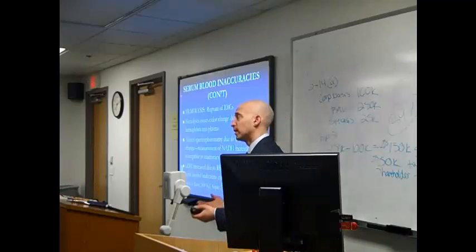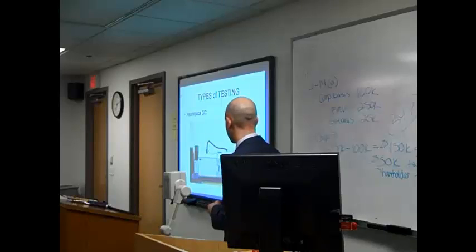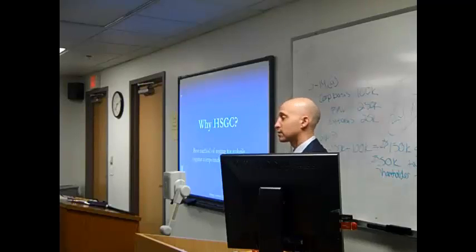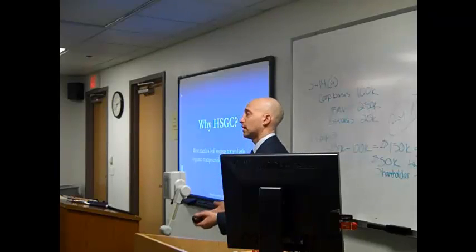What's in it, and if we know enough about it. All right, so let's get into headspace gas chromatography. There is that wonderful instrument, the headspace gas chromatograph. Why use it? Well, it is the best method for testing for volatile organic compounds such as alcohol.